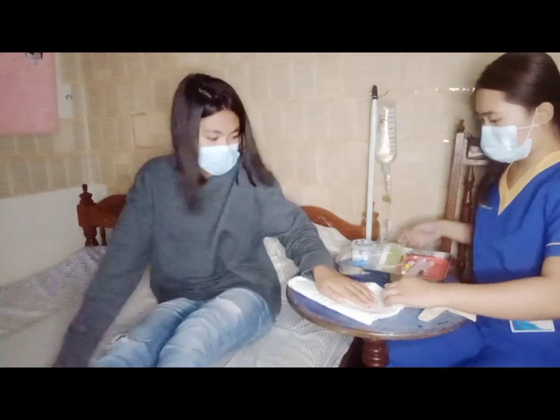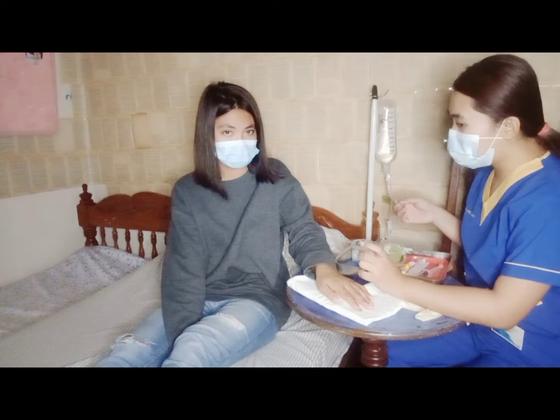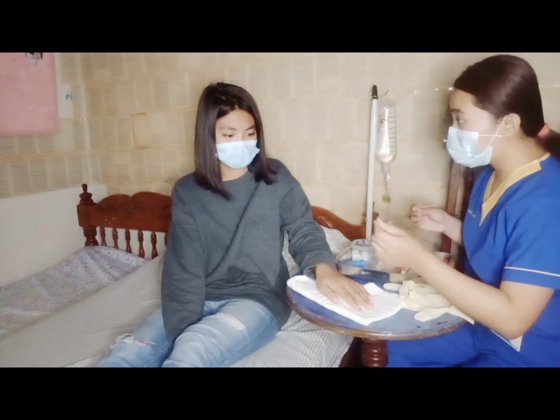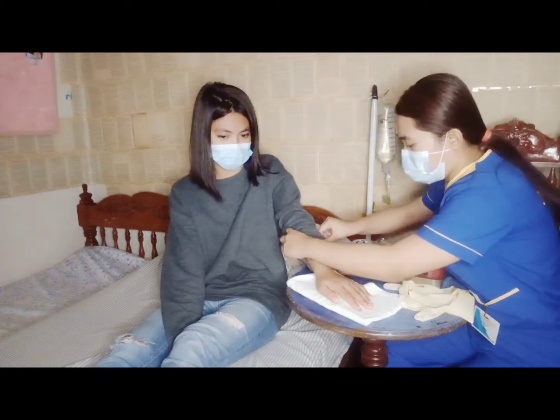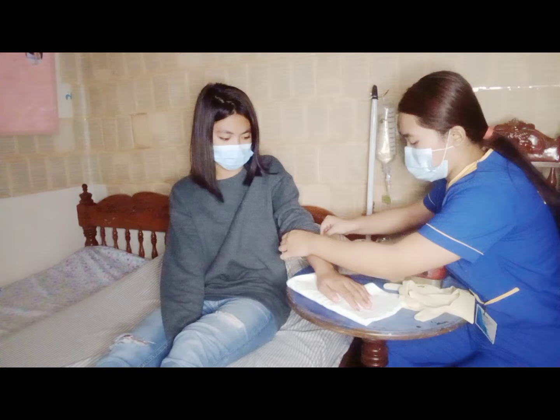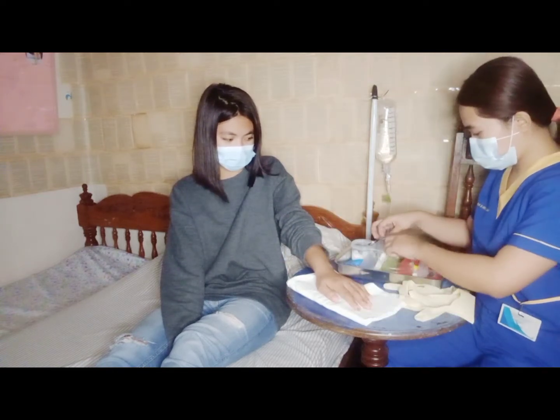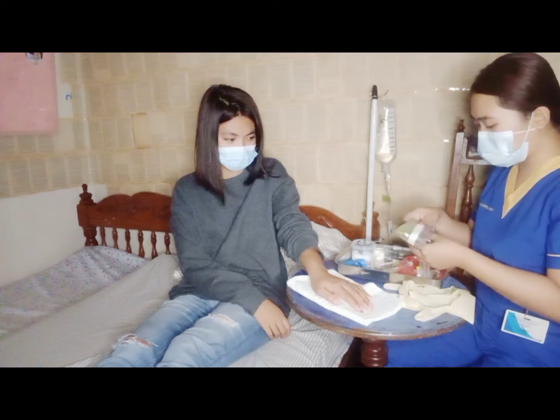Ito pong procedure natin ngayon, ma'am, hindi naman po yung pang matagalang sakit. Pag naipasok ko na po yung needle, wala ka na pong mararamdaman na sakit. So, ayos po natin ito. Okay, ganyan. So, open the extension tubing.